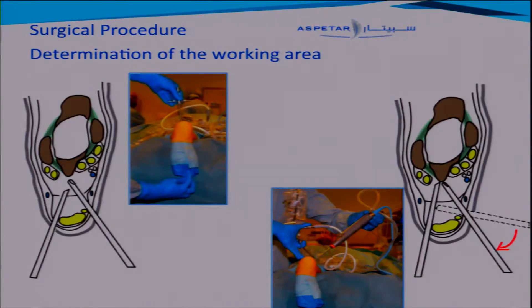Once we've seen this area with FHL and bone, we determine our working area. We come from the first web space towards a more oblique angle. When we use this oblique approach, we pull back our scope and go in an oblique 45-degree position — this is our working area.